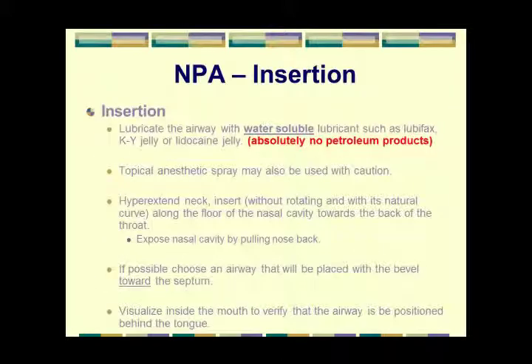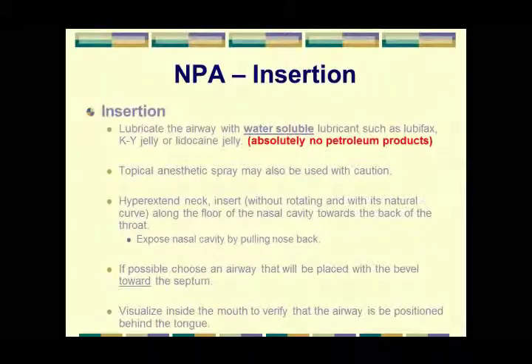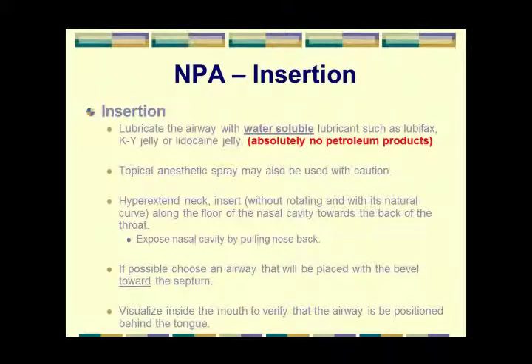We talked about this before. Should have a water-soluble lubricant. Definitely do not use a petroleum-based lubricant to lubricate it. And basically you want to just hyperextend the neck. Shouldn't need a lot of rotation of the device itself. Sometimes if somebody has some nasal polyps or ends up having a little bit of a deviation of their nasal septum, you may need to rotate a little bit to help facilitate passing it through. I always talk about making a pig nose, so I can see the floor of the nasal passage much clearer.